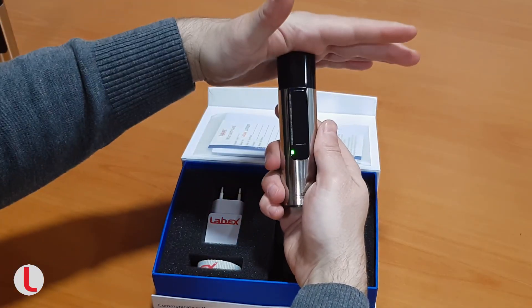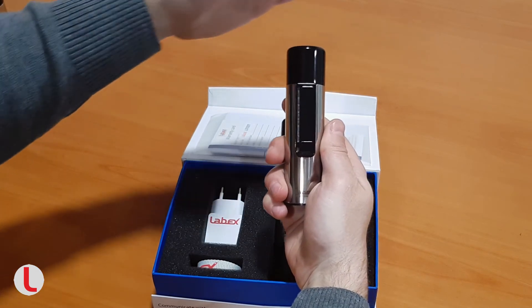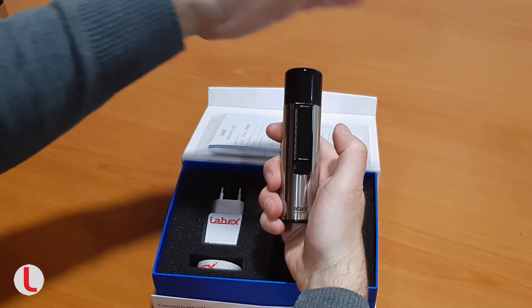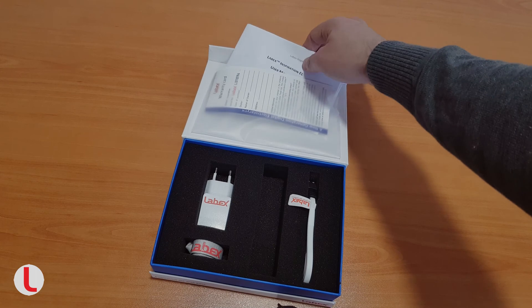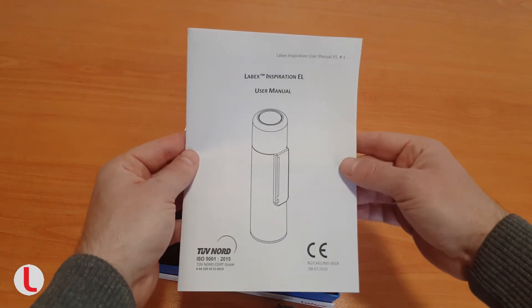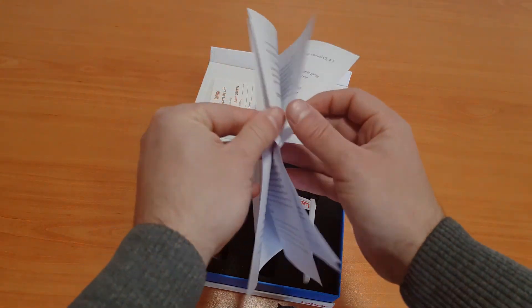Choosing the start-stop source: the sound can be started and stopped by touching the touch panel or the top cap. Which tonal variation you choose depends on your preferences. The exact setup procedure is described in the user manual included in the box of the device.